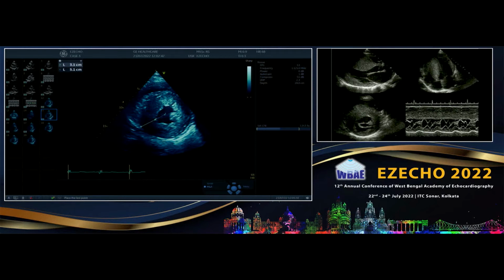This is not something guideline directed, that you measure in the radial direction, but you should have some standardization. So that is why you do it. And I think this is much more reproducible rather than doing anything as you want. And it should be perpendicular, correct. 30. This is a pretty good way, I think.